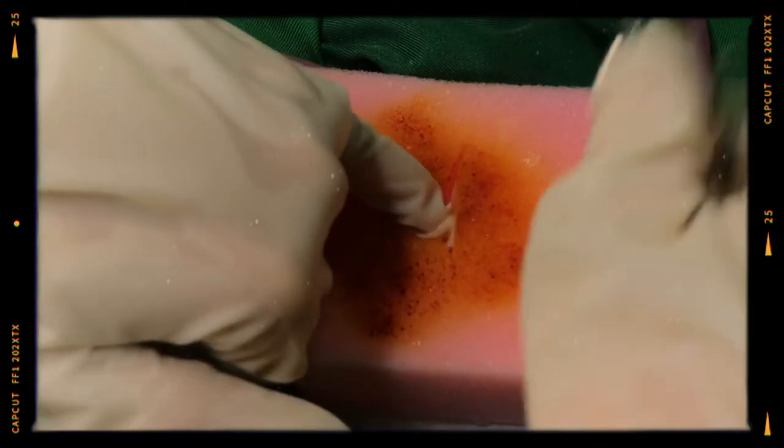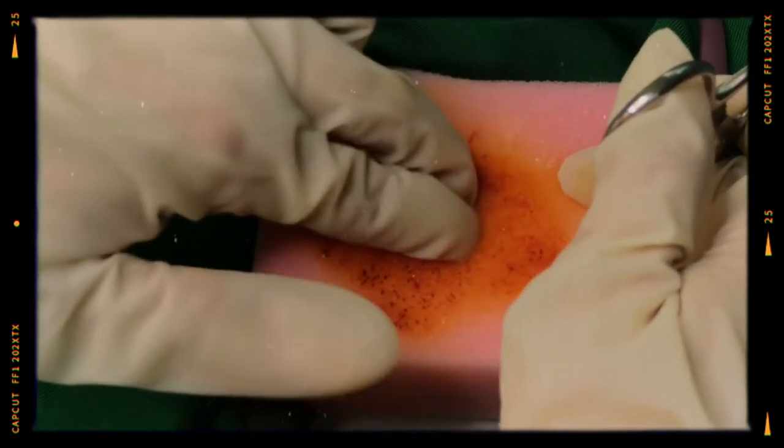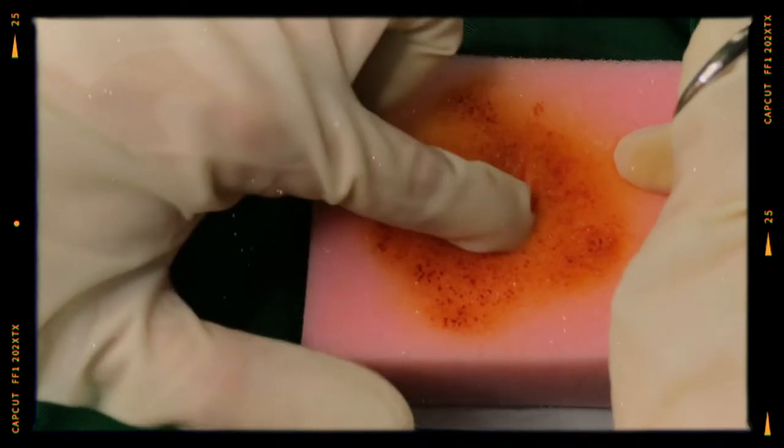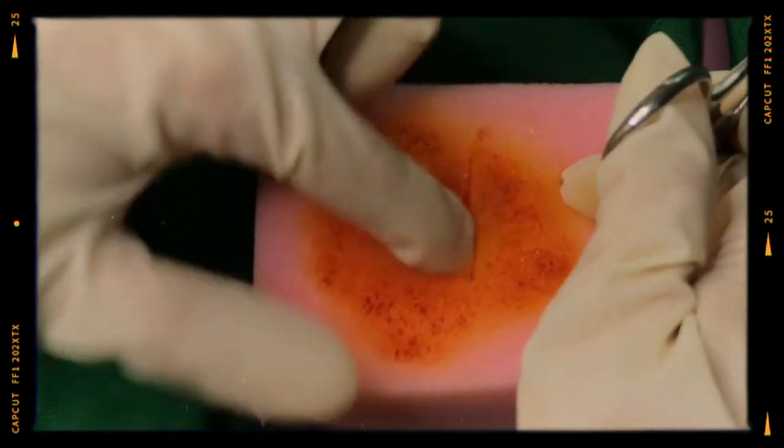After the pleural cavity has been entered, insert the gloved finger to explore for adherent lung and then further enlarge the opening in the pleura by inserting a large kelly clamp and spreading it.